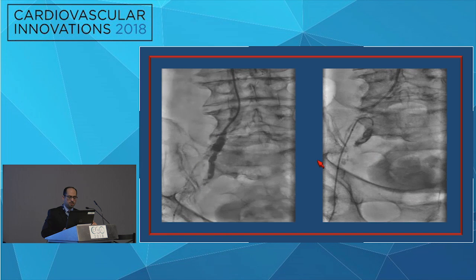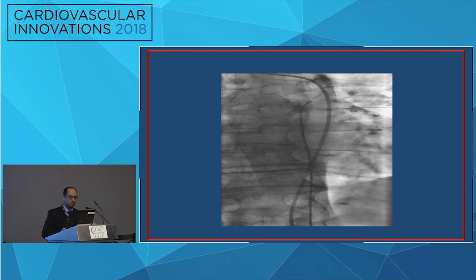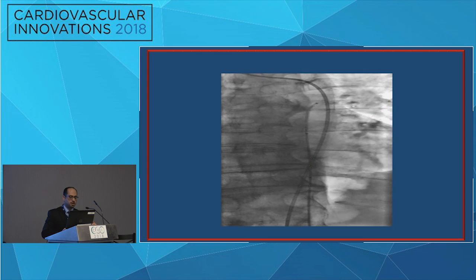So I used a Navicross and Gaia third, was able to make some progress here, then advanced the catheter. It actually deflected itself down, and at that point I was sure I'm in a true lumen. I injected here. I was in the internal iliac, then pulled it back and deflected back up, advanced Gaia third all the way up to the aorta. I compared pressure and made sure that I was in the true lumen in the aorta, which was the case.